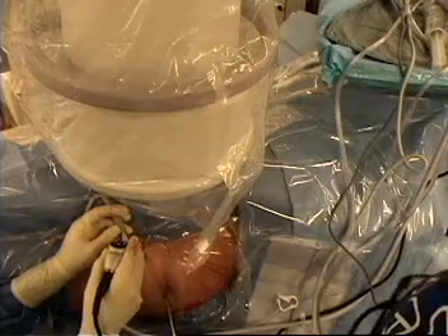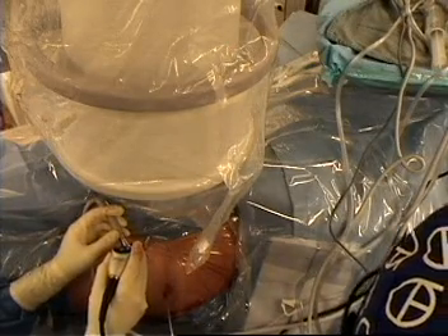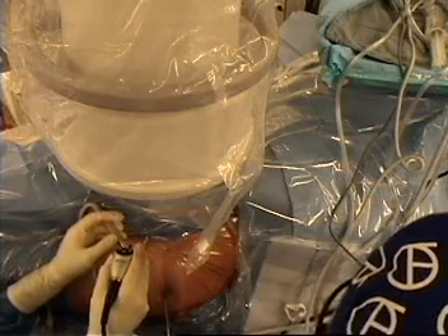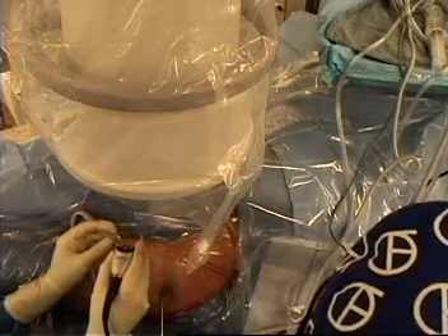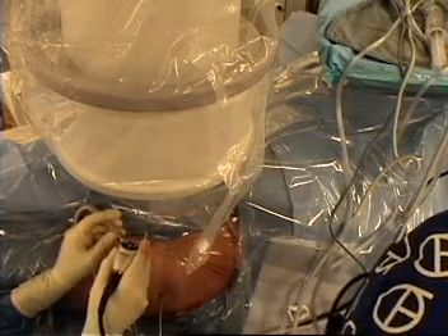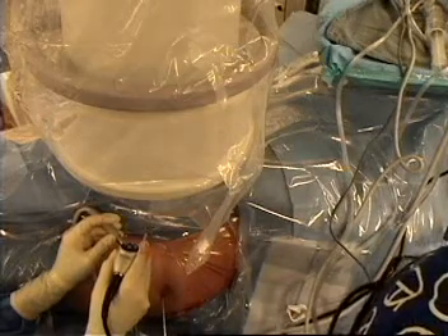This is a shaver with a high-speed blade. What this is going to do is open up the space. I am looking at the space between your labrum — you can see on the left there — and the capsule. You also have a little over-coverage of the bone here too, so this is why we are going to take it down and shave off the bone.